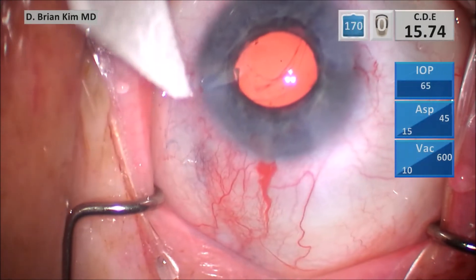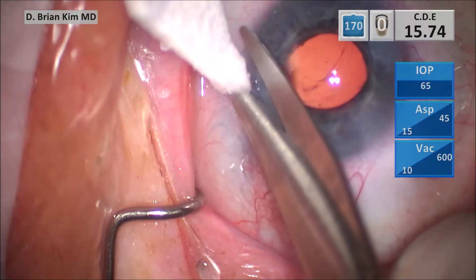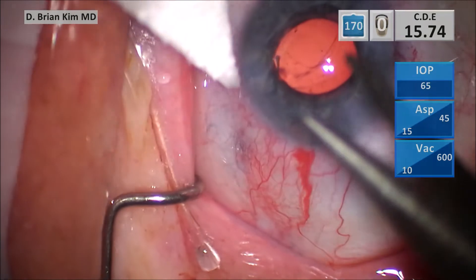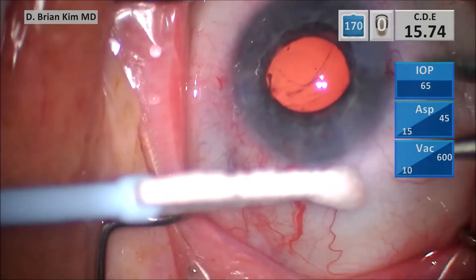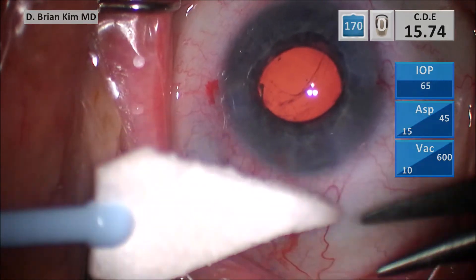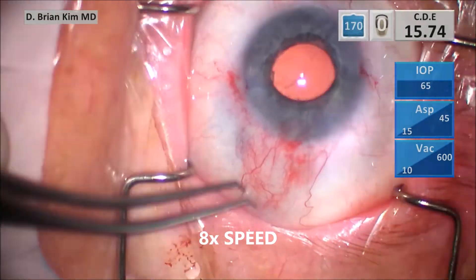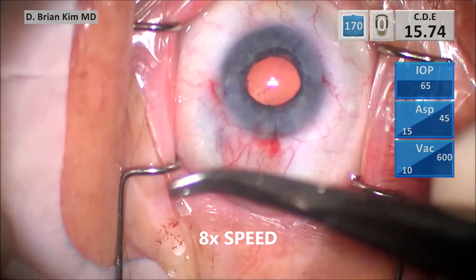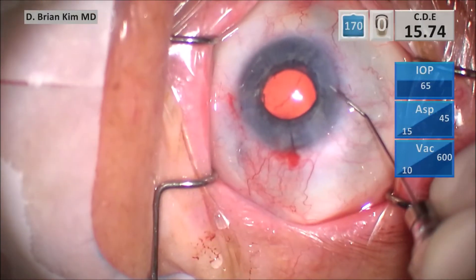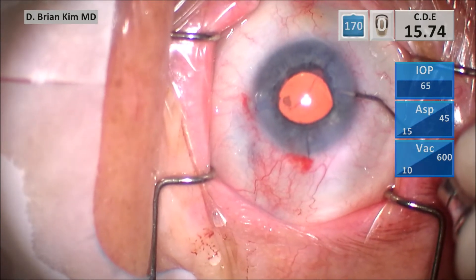Right here, rather than pulling away, I know there's vitreous — I'm just holding the Weck-cel there and trimming. You're not yanking back with the Weck-cel just to see if you have vitreous; I know I do. Just hold it there and use the Weck-cel to grip the vitreous, then amputate. By doing it that way you're not yanking on the vitreous base. Once I trim the vitreous, I go ahead and place a 10-0 nylon suture over my main incision, bury the suture, and then inflate the eye — because the high infusion pressure hydrated the vitreous, which caused the chamber to collapse.